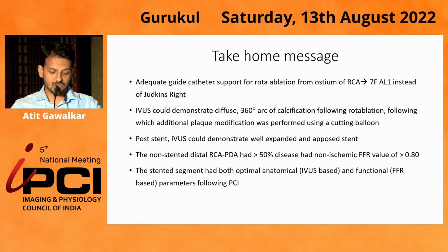And post-stenting, IVUS demonstrated a well-apposed and well-expanded stent. And after angioplasty, we had an ambiguous PDA lesion, for which we did FFR, which was non-ischemic. So we could easily leave it. So finally, we had optimal anatomical and functional result for the PCI.